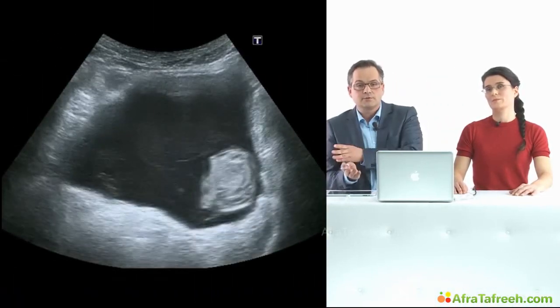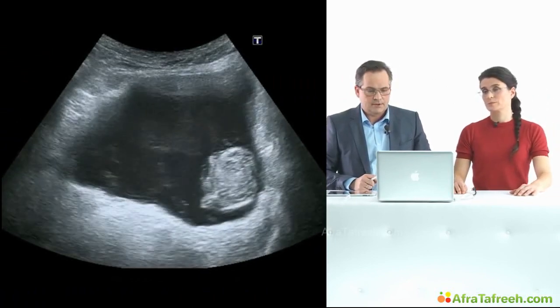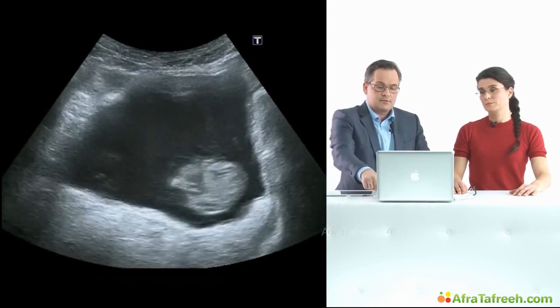Do you have an idea what to do? I think I would try to move the patient and roll him onto his side. Okay, that's exactly what we did. First, we rolled the patient, and afterwards, the structure rolled. So it was not connected with the bladder wall. So there was a history of oral anticoagulation, and the patient also had the problem that he couldn't urinate before. So this was clotted blood in a blood-filled bladder with urinary retention, pain over there, and the patient has to be transferred to the Department of Urology.